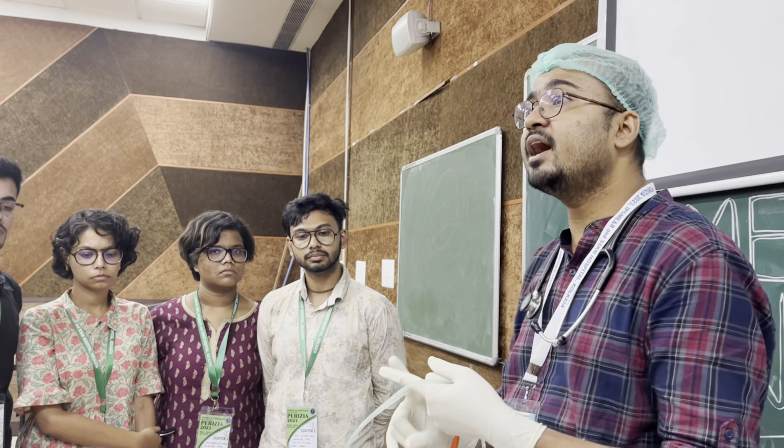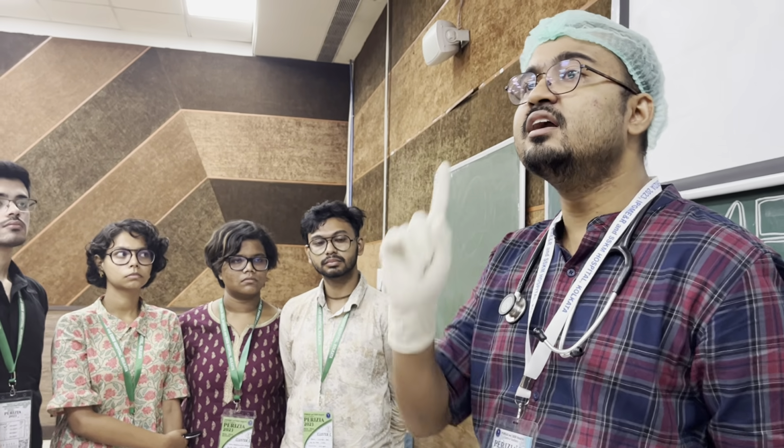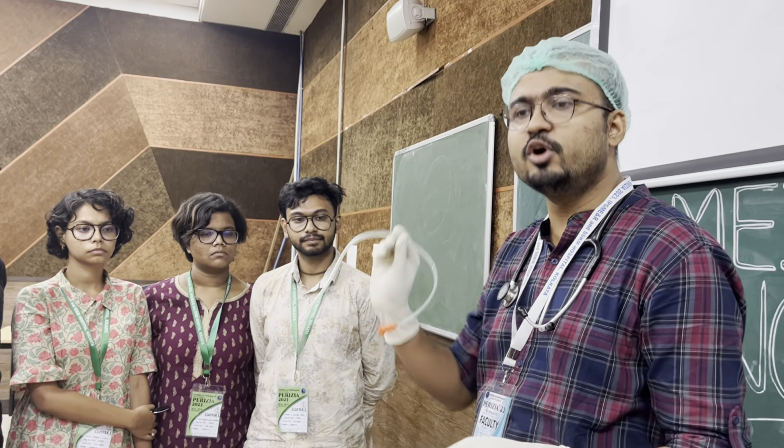Is it clear? But take consent from the patient, if the patient is conscious and alert. If unconscious or semi-conscious, take informed consent from the patient's relative and explain the need for this tube. Okay, then I am going to insert this tube.